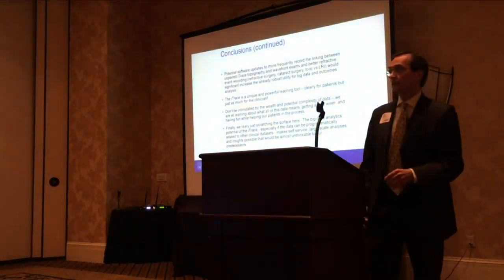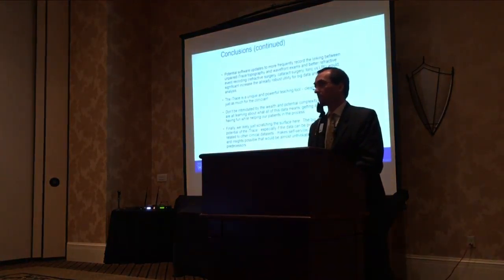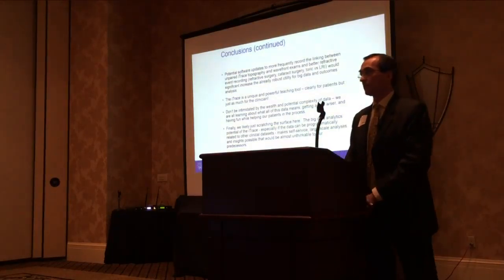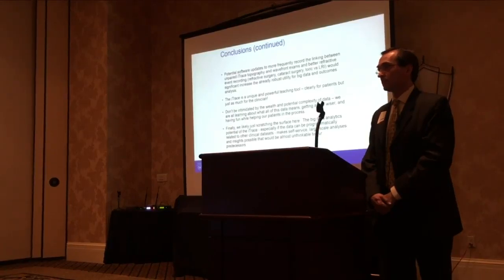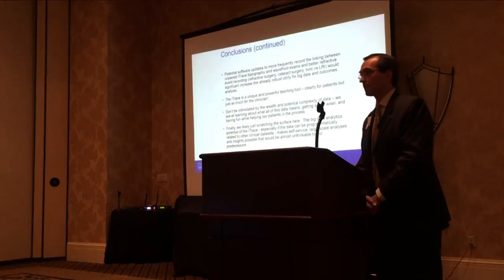Great, just a quick follow-up to that. We did that a couple of times in the practice where we just manually centered circles on rings that were visible. I can't say that you'd be able to do that on all multifocal lenses, but we were able to do it and then manually measure the true angle of the IOL versus the visual axis. I can't say that you can do it all the time, but it did work in a few instances for us.